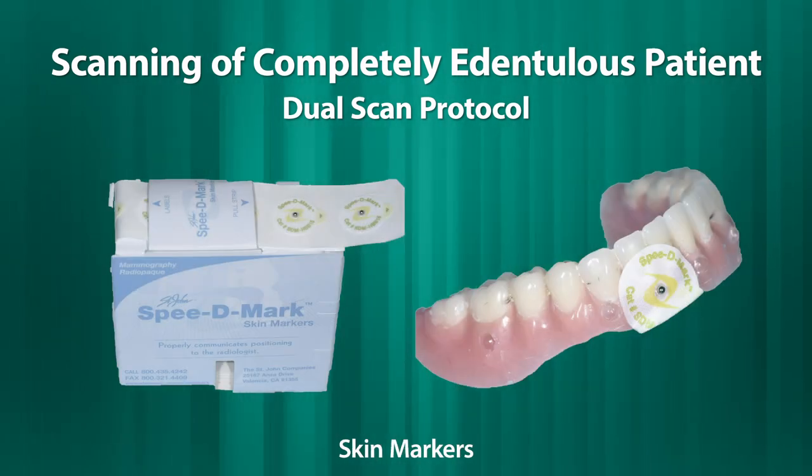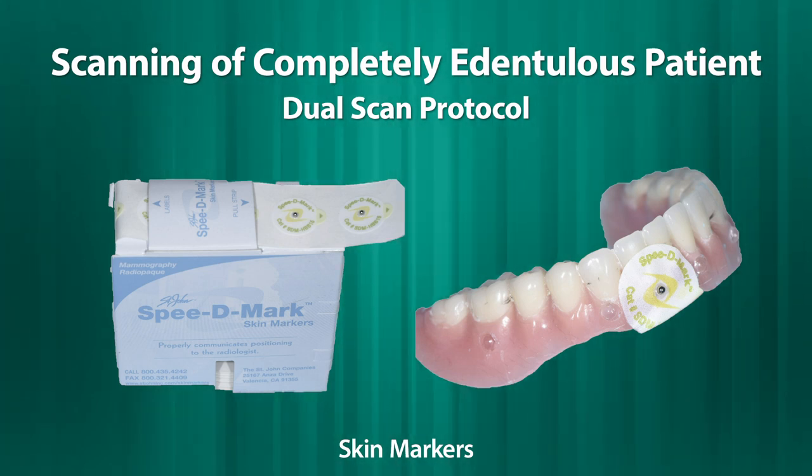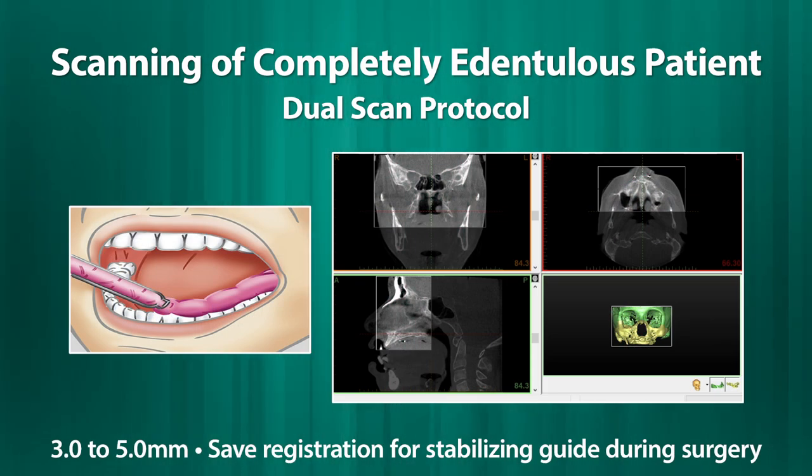Or you can use 1.5 or 2 millimeter skin markers, which can be placed on the surface of the denture, as you can see in this slide. During scanning of the patient with the denture, the patient should be biting on a bite index, which is 3 to 5 millimeters thick. It stabilizes the upper and lower denture in place. Also, it is your reference for stabilizing the upper and lower surgical guide during surgery, so you don't throw it away after scanning.